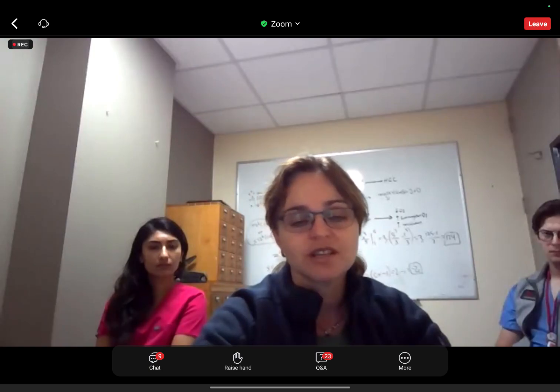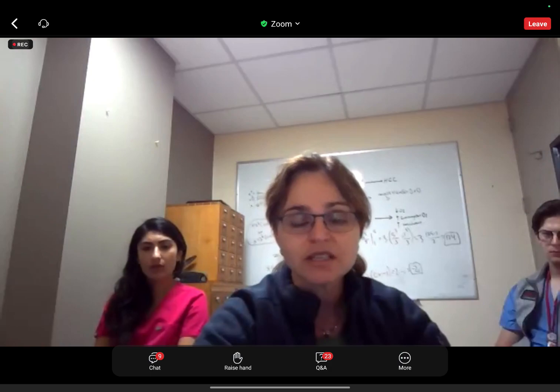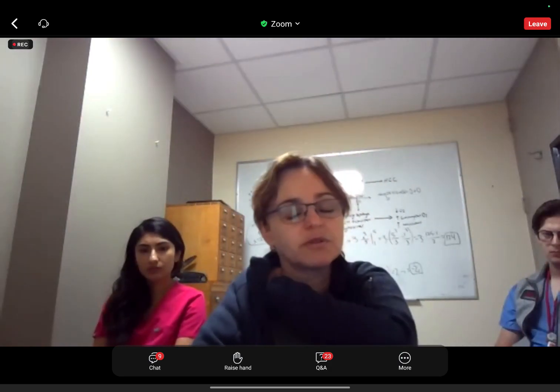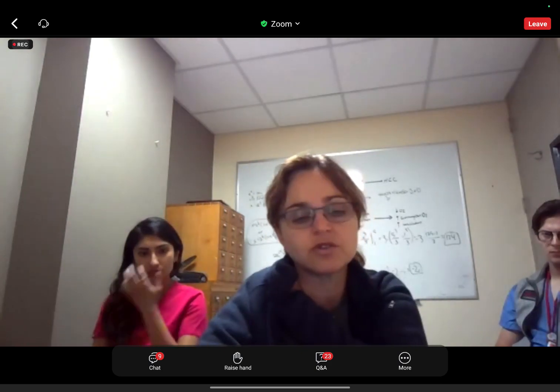Another fabulous question. And there are some people who believe that transitional phase is unnecessary, really unnecessary, because hepatobiliary phase is more important. Transitional phase is really not an additive. The reason why we acquire it is twofold. First of all, you're waiting for hepatobiliary phase anyways, and it's another 30-second acquisition. Patients already on a scanner. So it doesn't add anything in terms of time. So it's easy to acquire.